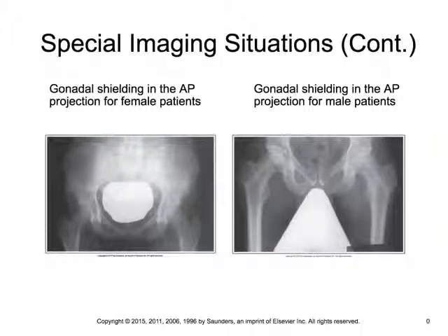So if there are policies and protocols that we can put in place to do this, if all I'm interested in, like on the image on the right, is their hips, I'm not going to gain any information from seeing that soft tissue there. So if I can avoid clipping the bony anatomy and protect the gonads of this patient, that's appropriate. But again, this is stuff that we would need to vet with the department, right?